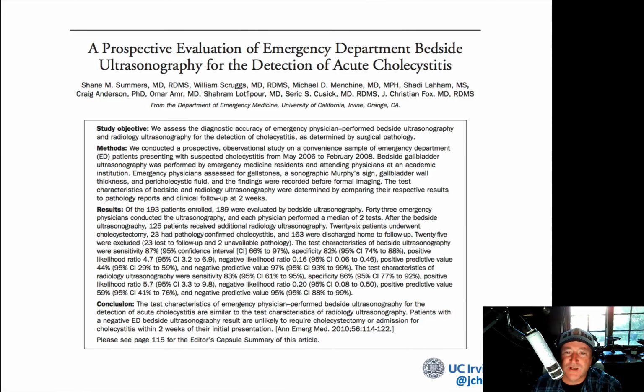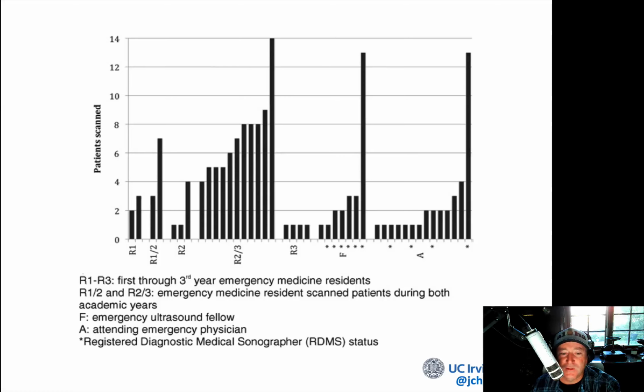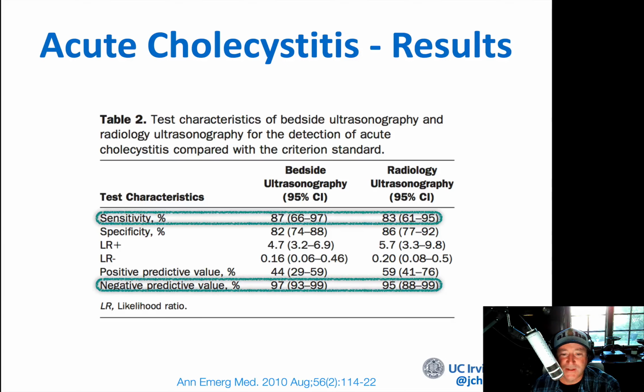Oh yeah, we did a study comparing ourselves to radiologists, and it was prospective, and we were looking at pathology reports for patients who went to the OR, and for people who didn't go to the OR, we called them all back at 2 weeks. We had a bunch of different people doing these scans. It wasn't just me and my fellows. It was some fellows and a bunch of different attendings, a mixed bag of folks doing this ultrasound. And we enrolled 189 patients. And basically, the test characteristics are here.